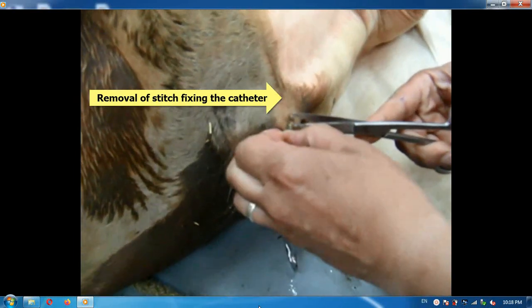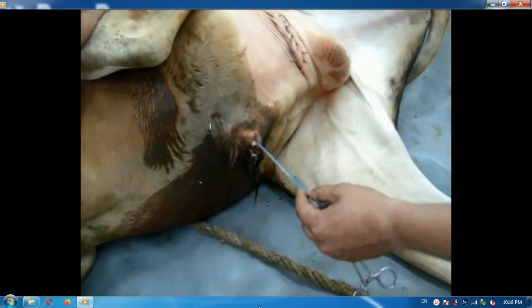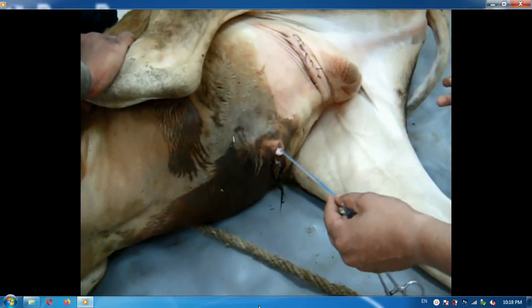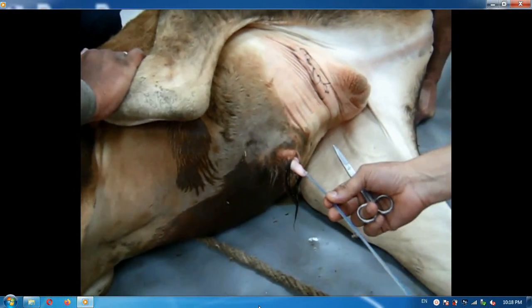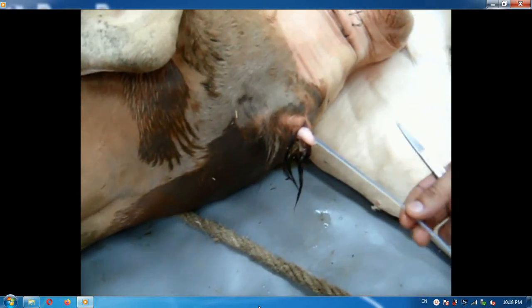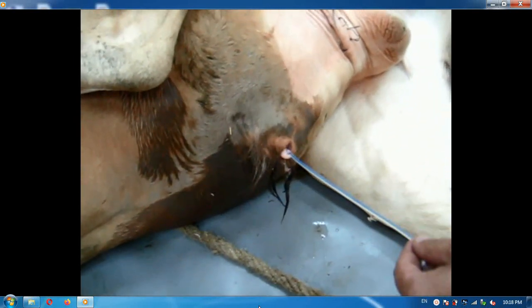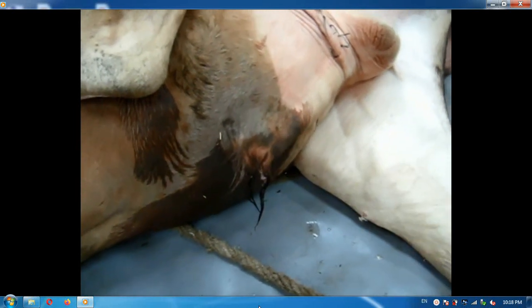We remove the stitch fixing the catheter, then the catheter is grasped and withdrawn slowly and smoothly.